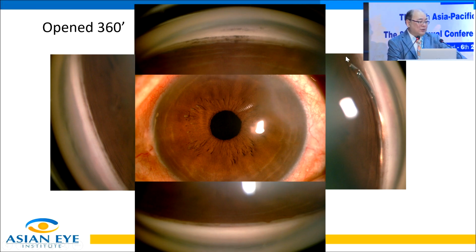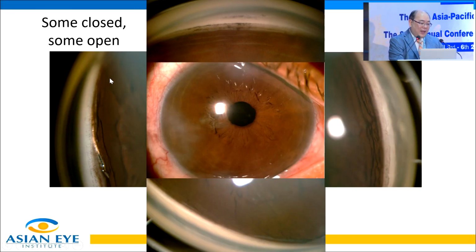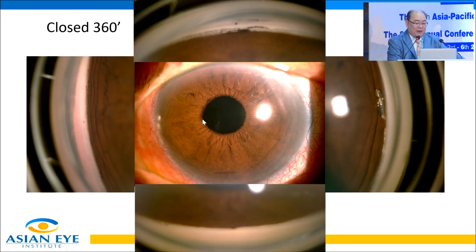This is the reason why the Hydrus is what I like for angle closure: it's like a straw, part of it is jutting out of the anterior chamber. Even if later on you see that some of the areas are becoming synechia again, the pupil creeps up, and even if you do GSL, it will close again because of the Hydrus jutting out. It still drains fluid behind the TM. So this is like 360-degree closed again, but since the inlet is open, it still drains fluid.